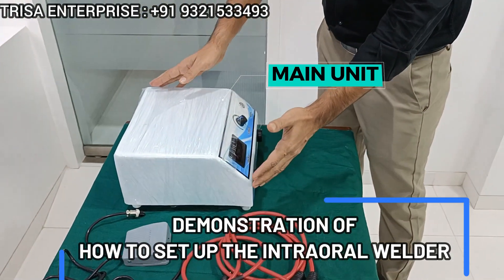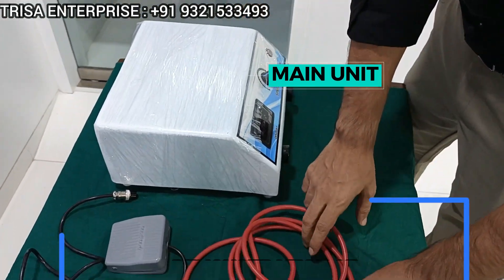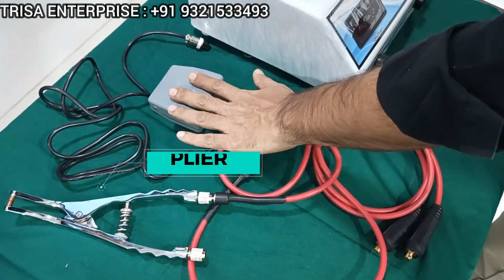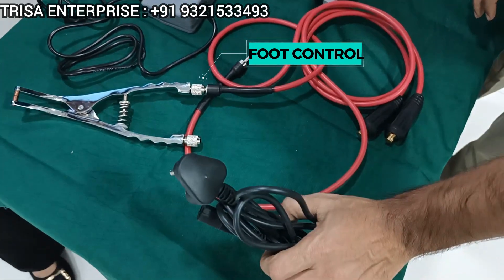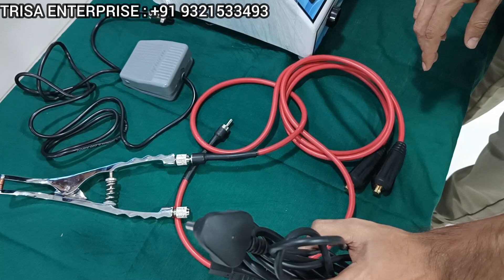So this welder will come with the main unit — this is the main unit. These are the wires which get attached to the plier. This is the foot control and this is the master plug. Make sure that the earthing is available wherever you connect this 3-pin plug.